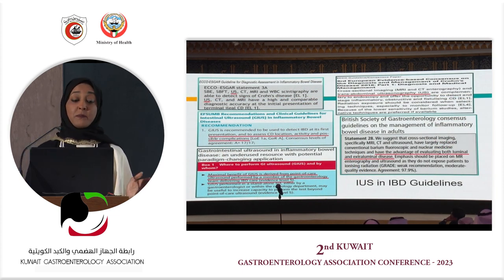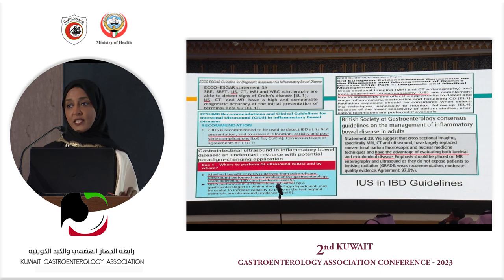I won't say that it's a toy, but most of the doctors who know how to do bowel ultrasound are very interested to know: is it there in the guidelines? And we're really happy to know that the ECCO-ESGAR guidelines, mainly the European guidelines, and the IOIBD guidelines now include bowel ultrasound as part of diagnosis and measurements. And even crossing the oceans all the way to Australia, bowel ultrasound is also one of the modalities that can be used to monitor and follow patients.